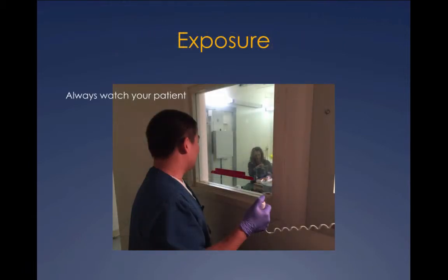Lastly, in the exam process is the actual exposure. Ensure that you're always watching your patient so as they don't move during the exam and you expose unnecessarily.